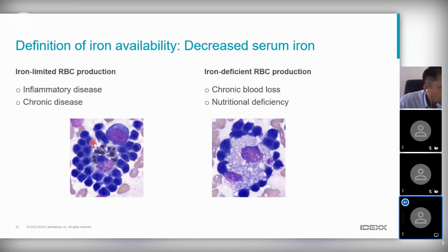Whereas in this, you can see that the cells have surrounded the macrophages, and here the iron is sequestered in between for its availability, but it is not available. It is just sequestered. So this was just for the understanding. Over to you, Professor Tan.